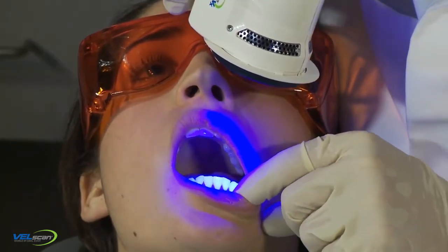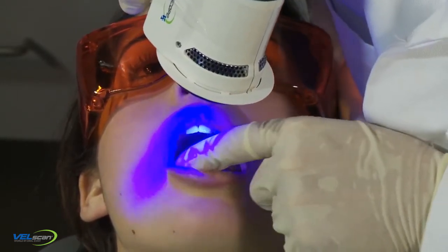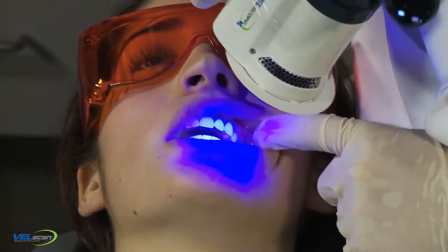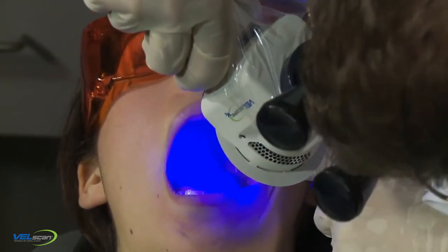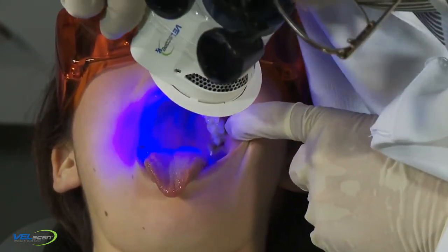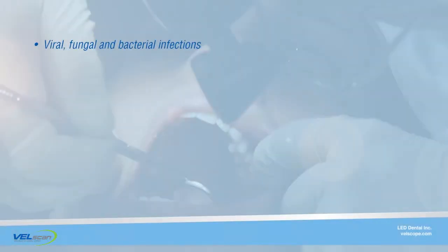In addition to the detection of dysplasia and cancer, the VELscope system is a valuable tool for the discovery of conditions that may not present with obvious oral change when viewed under white light, either because the condition is in its early stages or because the nature of the lesion masks the underlying inflammatory change. These conditions may include viral, fungal, and bacterial infections.